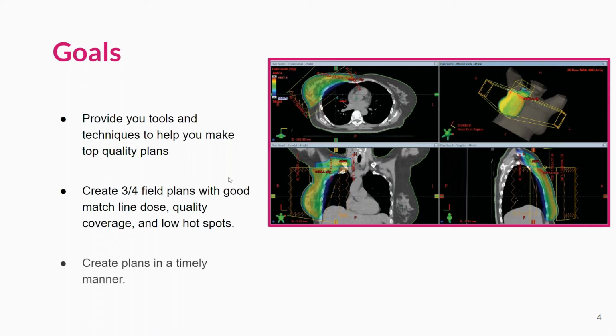And then to do all of this in a timely manner, right? So most of us don't have 2 or 3 days to complete these plans. If we did, we'd create perfect plans, but we don't have that time. And that's where EZFluence comes in. It's going to give you, as you all know, quite a few different plans that you can show the physician in a very quick manner.